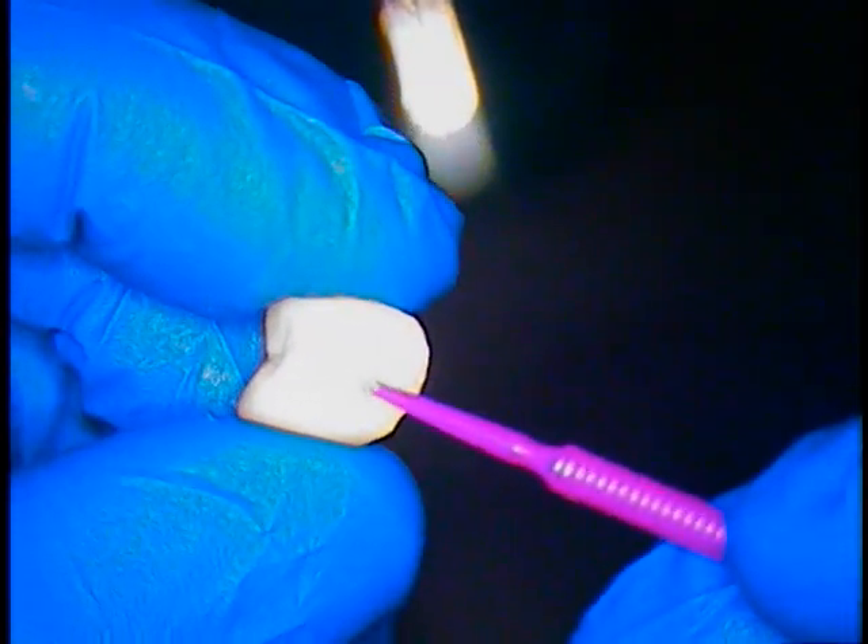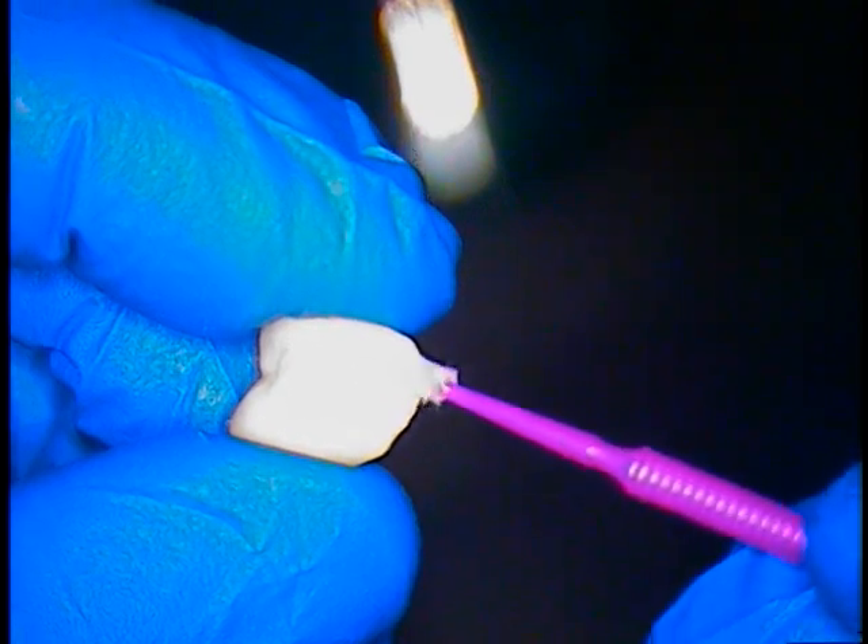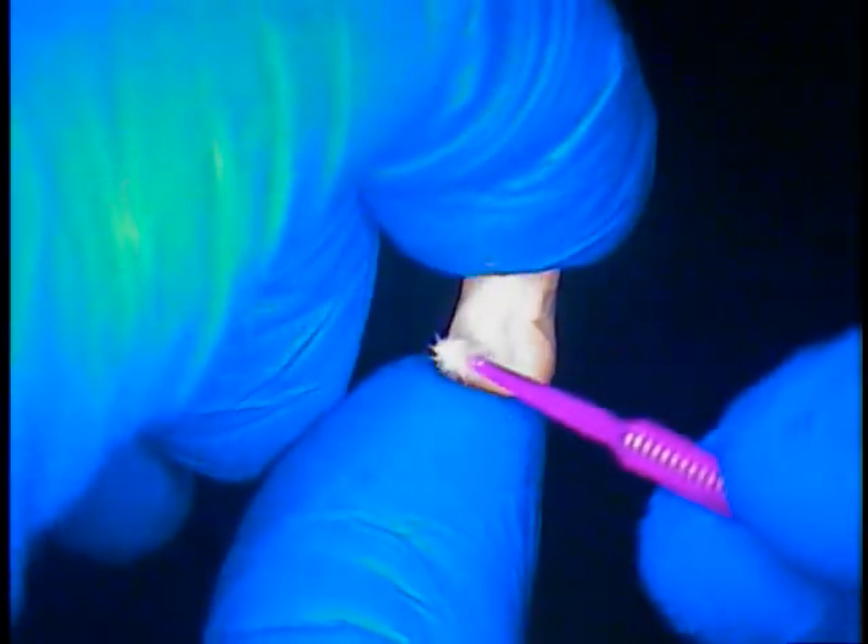We've already fit-checked the case. We double-checked it, triple-checked it. And you can see how long one side of the crown is — we look at the other side as well. Let's set those in a safe place.